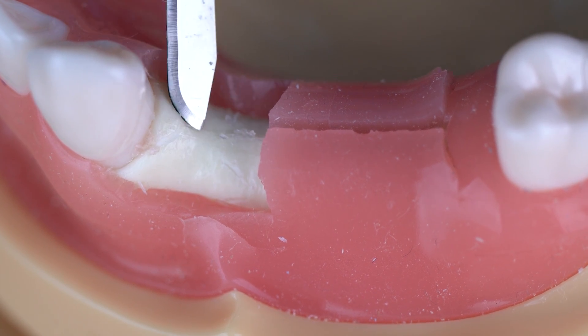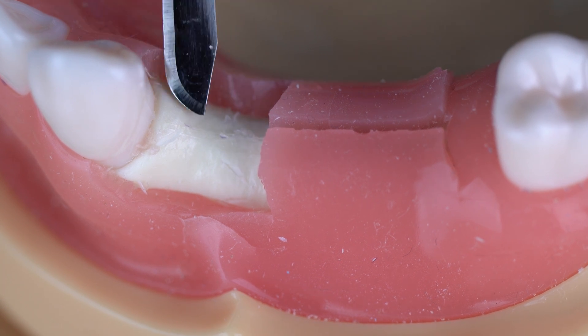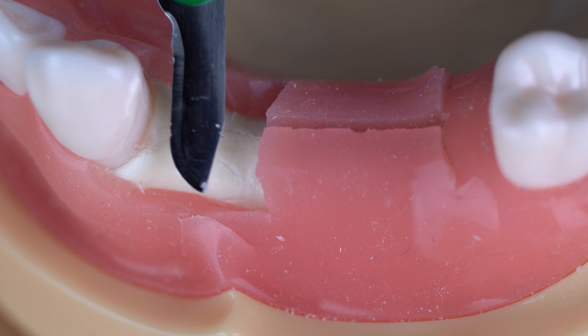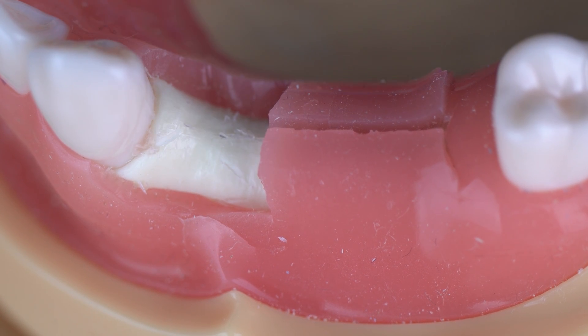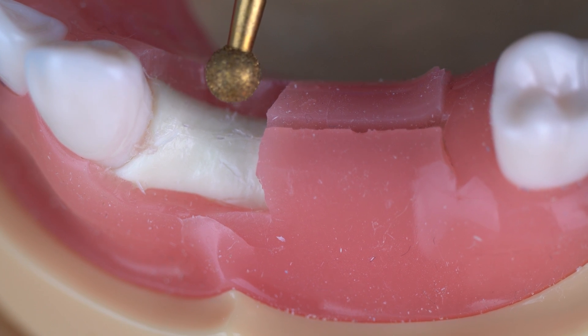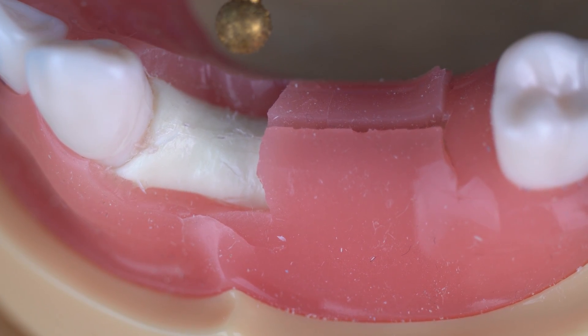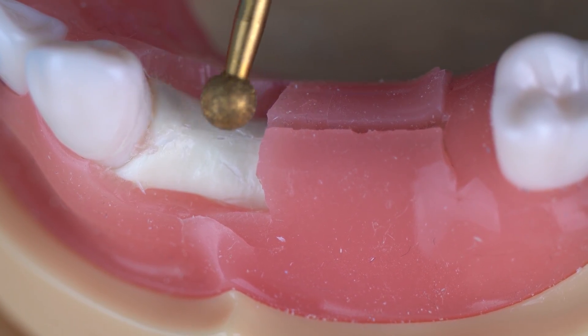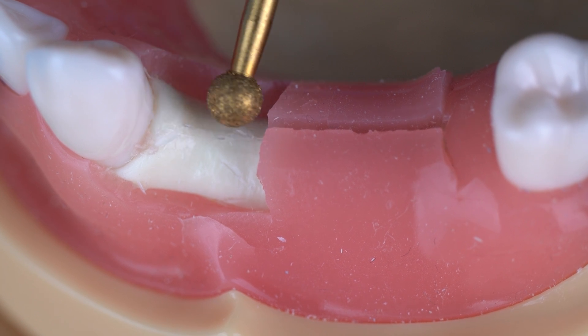You will obviously not be doing this on a real patient — you won't be cutting away their gums. This is just to show you the ridge better, so don't do this. Now, approach the ridge with your drill and make sure your water on the motor is turned on. Run it before it touches the bone, then use it to lightly adjust the ridge.